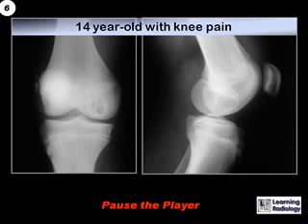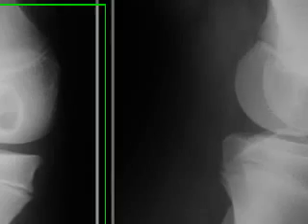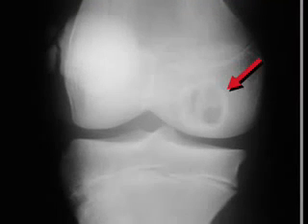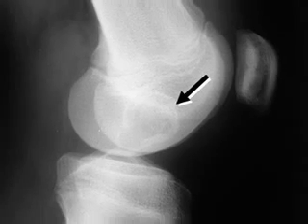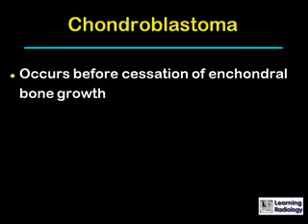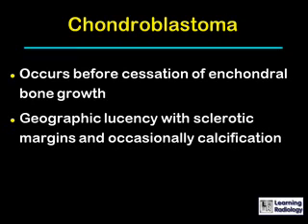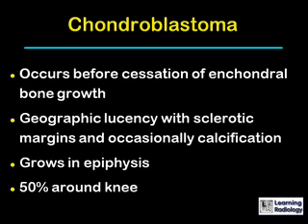The next case is a 14-year-old with knee pain. There is a lytic geographic lucency in the epiphysis of this growing child. It has a sclerotic margin and some flecks of calcification within it. This is the typical appearance of a chondroblastoma. Chondroblastomas occur in the epiphysis before the cessation of enchondral bone growth. They are geographic lucencies with a sclerotic margin, occasionally containing calcifications, and 50% of them occur around the knee. A similar appearing lesion in an adult is usually a giant cell tumor.